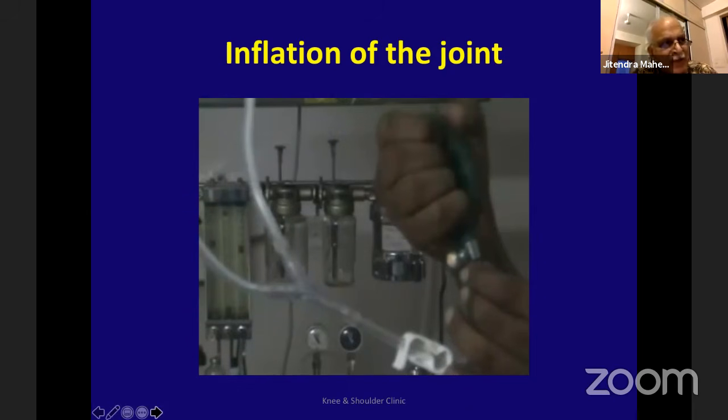And if you have a special IV stand which can be raised very, very much up, it is good. But most of the IV stands don't go so much up and they become unstable, they can fall, and that's an issue.